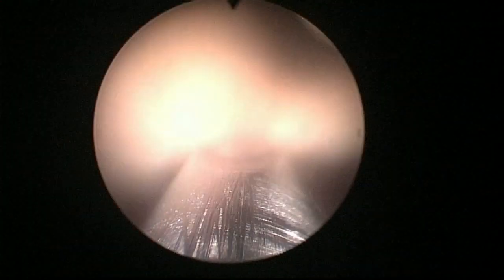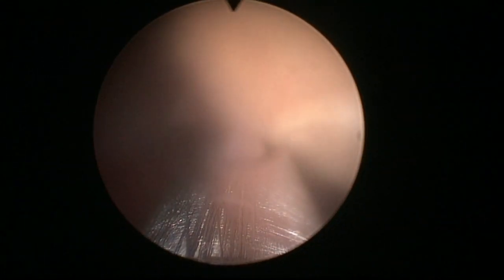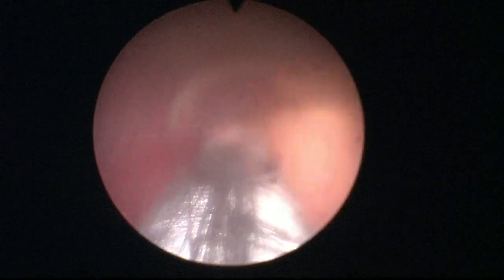Maybe the bucket of tissue is quite full now, and that can sometimes compromise the sucking force, the negative pressure. So the suction is a little bit milder, you see. Every time you change the deposit, it's important to also change the tissue basket, because the tissue tends to condense because of the suction. The suction has to go through the tissue basket, you know, the negative pressure is transmitted to the tissue basket.